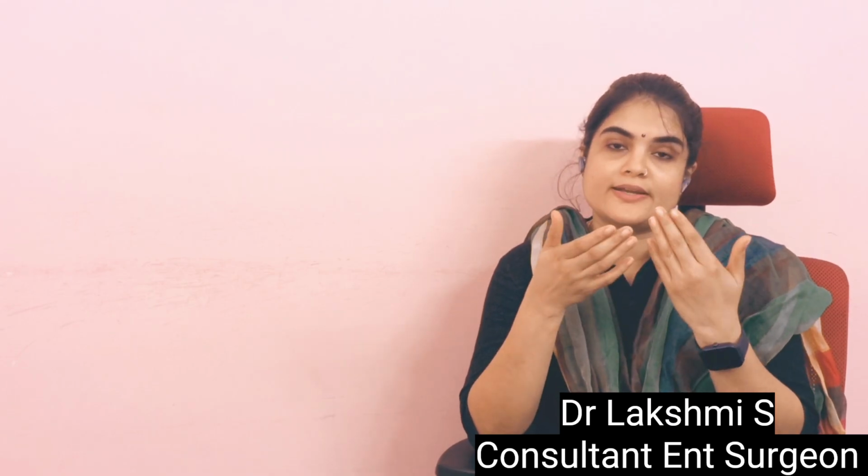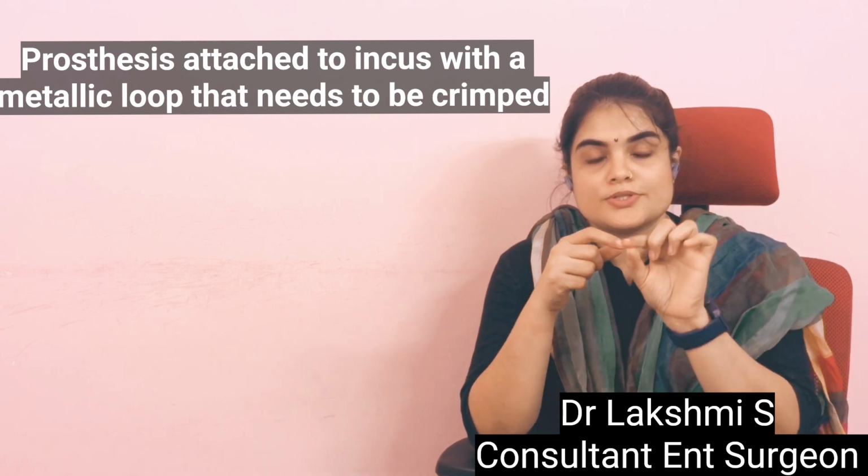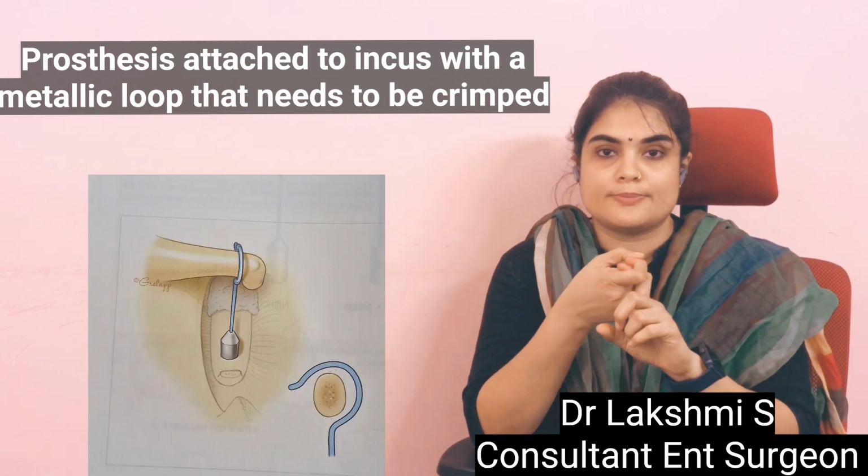So the piston can be of different types. Usually the piston will have a hook that you have to crimp to the incus. So introduce it into the fenestration and you have to crimp it to the incus.